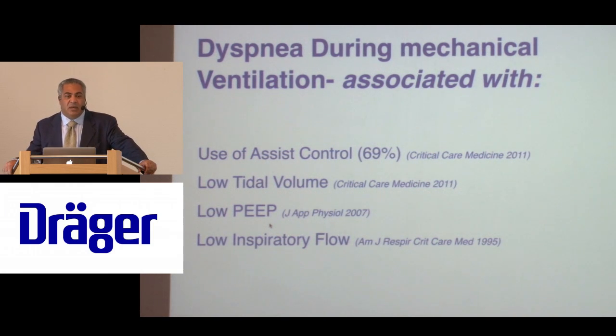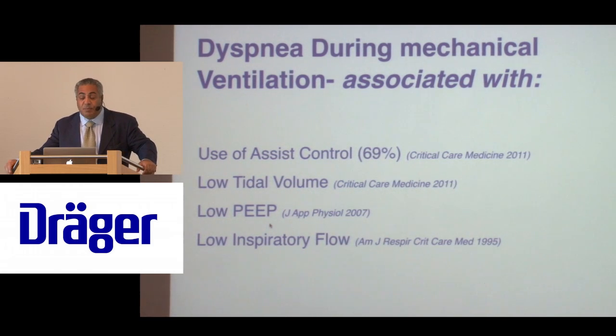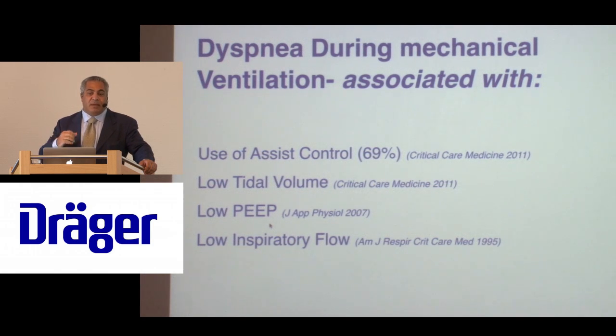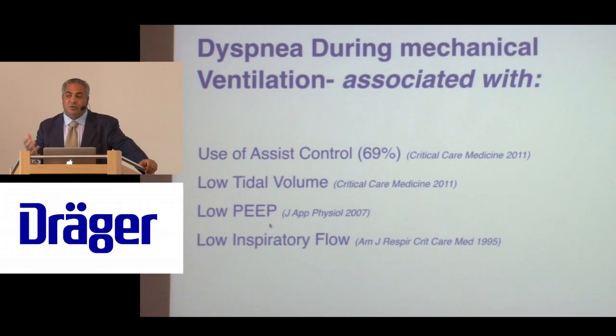So this is really the key thing, but we tend, as clinicians, to set it to, well, what's the PO2? And that may have nothing to do with restoration of adequate lung volume for the patient to begin their spontaneous breath. And to some extent, what we're doing with APRV, that's our goal. We want the patient to have adequate lung volume, and when you do that, we find they need no further assistance. We don't need pressure support. If you set the patient at the right lung volume, they will be able to breathe without any need for additional pressure at all. And of course, that would preserve a more natural breath and the inspiratory flow rate.